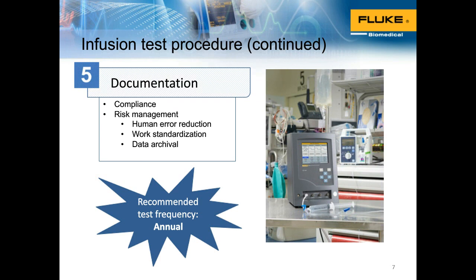And finally, documentation. You want to make sure that you are documenting the work that is done per the regulations of your organization. In some countries, this is based on the regulatory environment and how you're required to test infusion pumps. In other countries, it's not regulated. The organization decides whether they will create their own procedure for infusion pump testing or follow the manufacturer's recommended procedure for the infusion pump makes and models that they have. Generally, we see that most organizations go with the OEM service recommendation on what should be tested for infusion pumps.